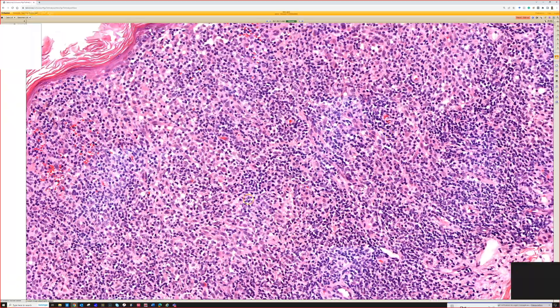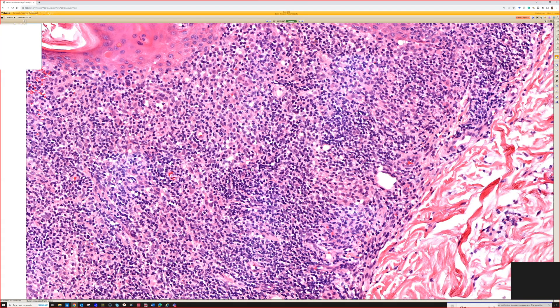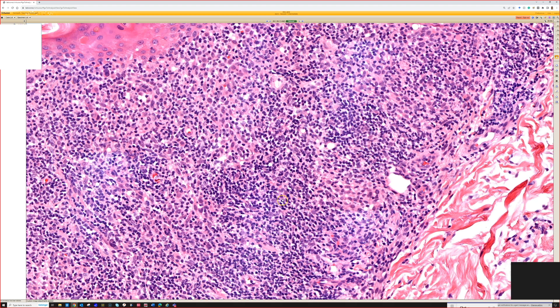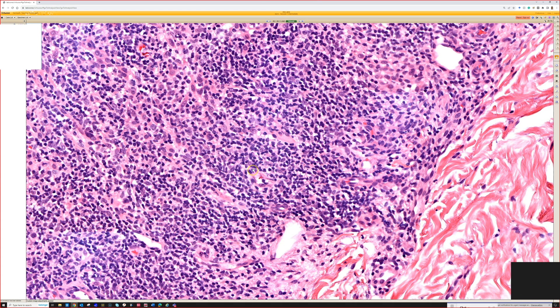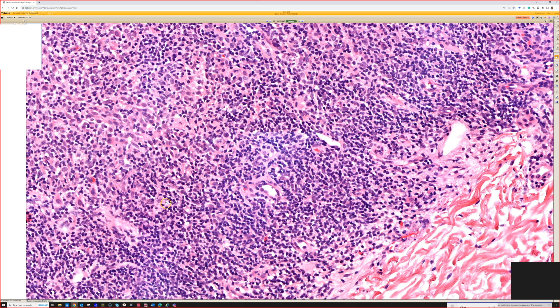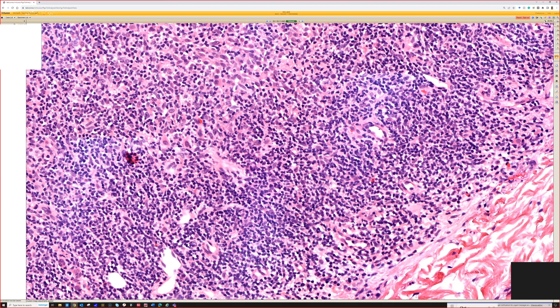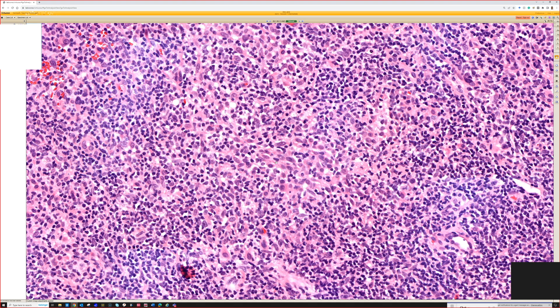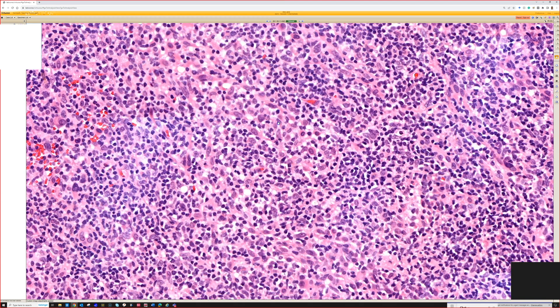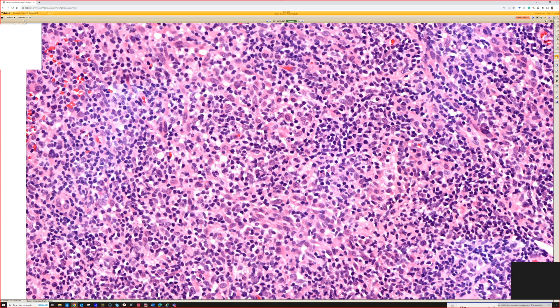What you just said can be quite tricky to figure out at first — recognizing that the bigger plump cells here are melanocytes, and the small dark cells are lymphocytes. In nevi, type B nevus cells can be lymphocyte-like: small, dark, and round. At close look they differ, but at lower power they can look very similar. Here the cells are more plump epithelioid type A melanocytes. You could have a hard time telling these apart from histiocytes — honestly, without context, I would have probably said these are lymphocytes and histiocytes.